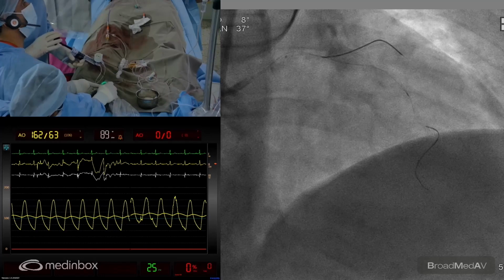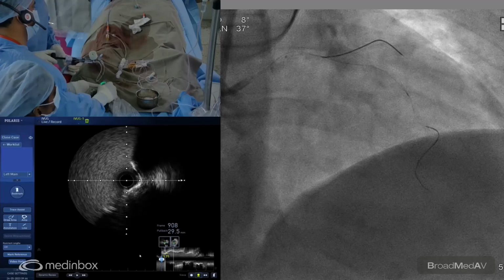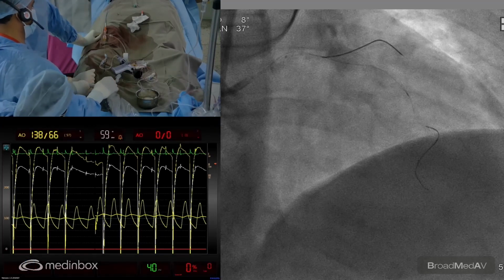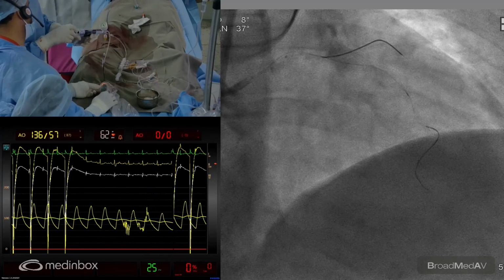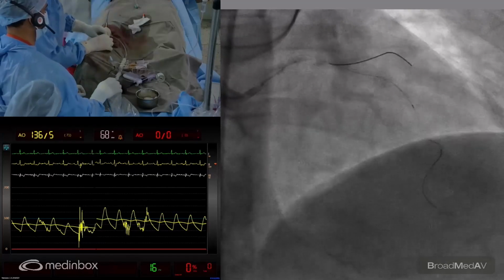So now we will do all the 10, okay? So we're getting to the next round. And now we are at 4. And now you press. 3, 4, 5, 6, 7, 8, 9, 10. Yeah. Pressure is dropping, sir, wait a bit. Deflate, sir. A second and we deflate. Okay.